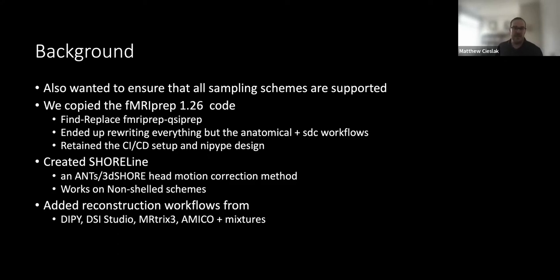But in addition to that, we also added a new motion correction algorithm that works on any non-single shell scheme that we call SHORELine. So it works for multi-shell data or Cartesian and random sampling schemes. And we added what we're calling curated reconstruction workflows.